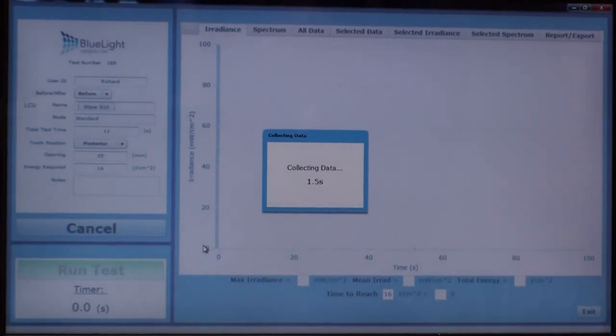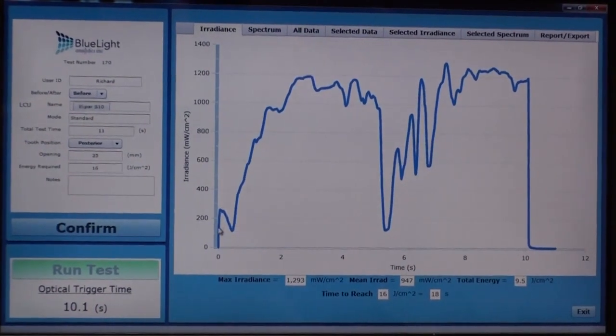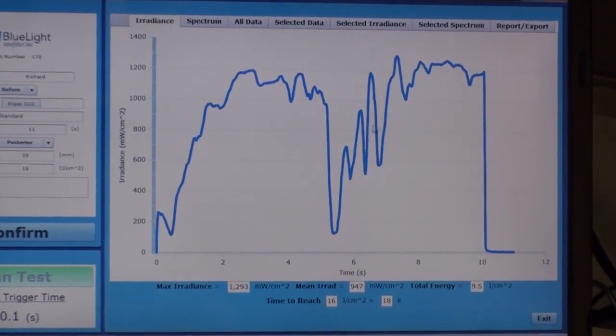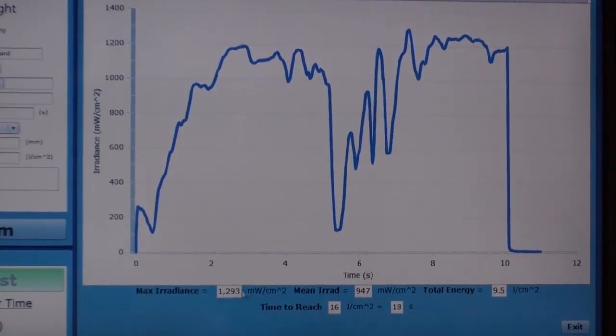We can see that data is being collected. There's a timer running. The timer will stop about a second after the light goes off. Here we can see the operator initially had problems locating the tooth. They then found the tooth, they slipped off, and then there was some movement on and off the tooth during the curing process until 10 seconds was reached.